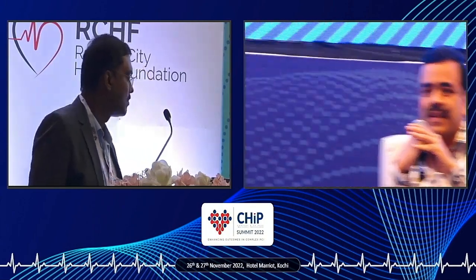Dhamodaran, one more thing. Could you tell us something regarding the catheter size? We know that 0.9 and 1.4 are the commonly used ones. Do you have both the catheters in your lab? I'm only having the 0.9. And how do you select the fluence and frequency?